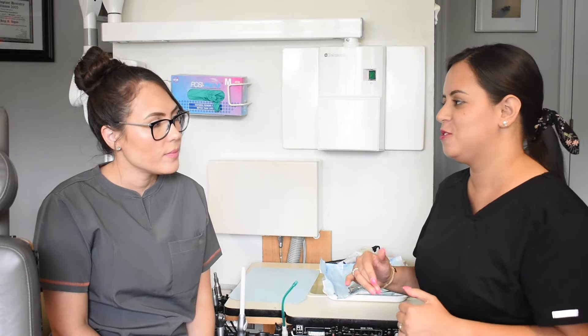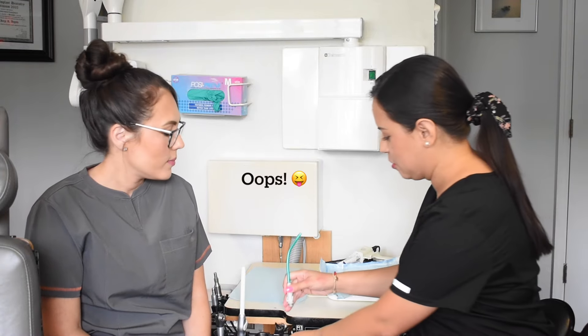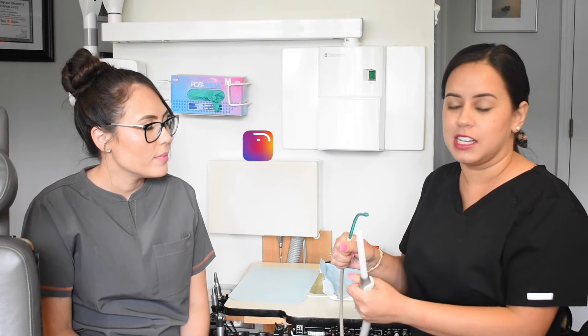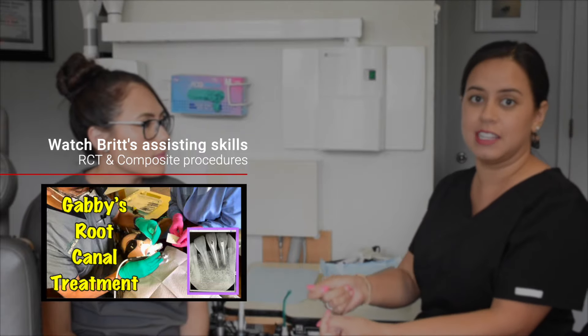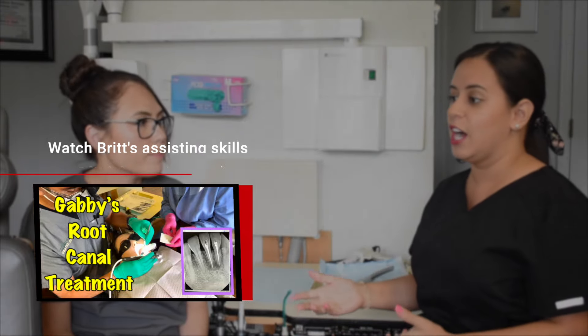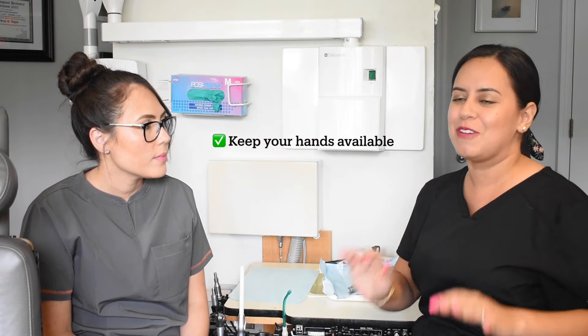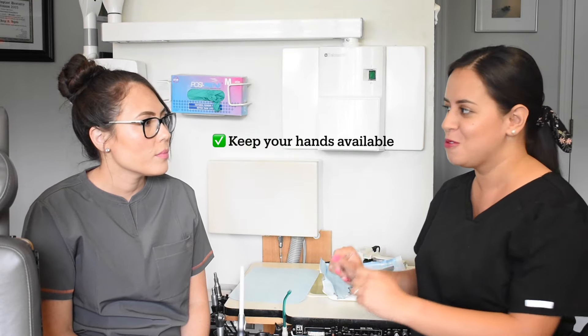At the beginning, I used to hold onto the suction for dear life, just waiting for the doctor. Since you're still learning how to work with that doctor, you can't hold on to things — you have to put things down and have your hands free. You may need to pass an instrument, pass a material, or even hold the patient. Keep your hands free; put things down.